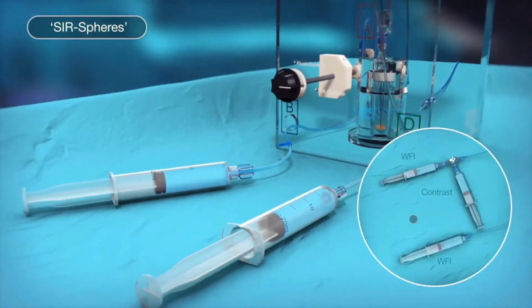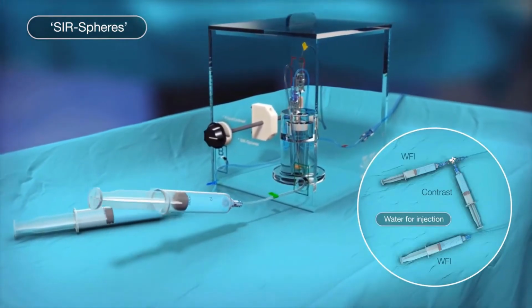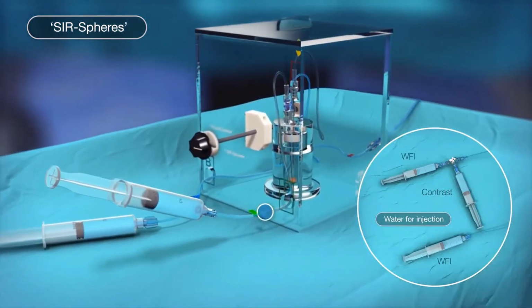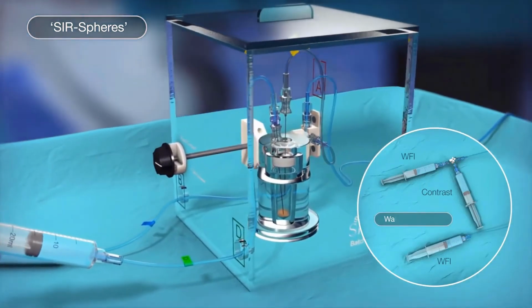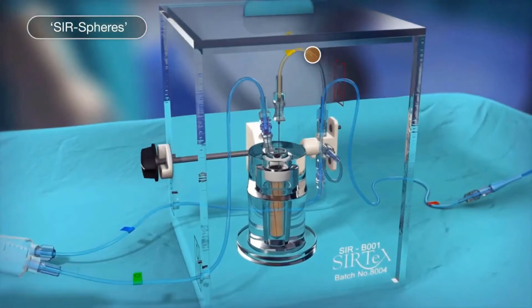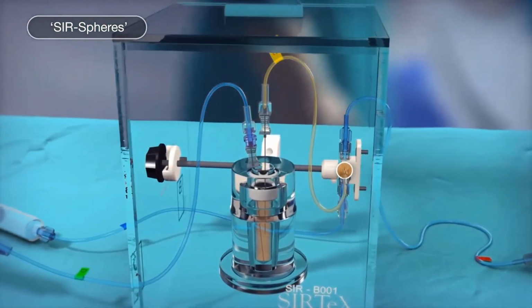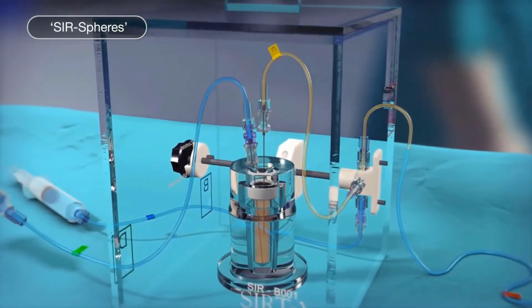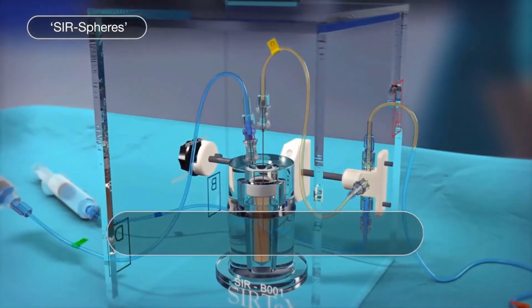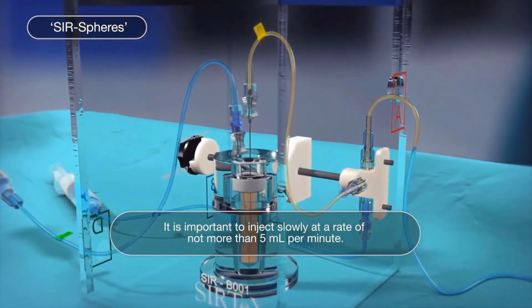Now administer D5W or water for injection from the 20 milliliter syringe connected to the D line in pulses of 0.25 to 0.5 milliliters, separated by a pause. This will cause the Spheres Y-90 resin microspheres to agitate into suspension, passing through the C needle via the C line into the A line, which is connected to the catheter. It is important to inject slowly at a rate of not more than 5 milliliters per minute.